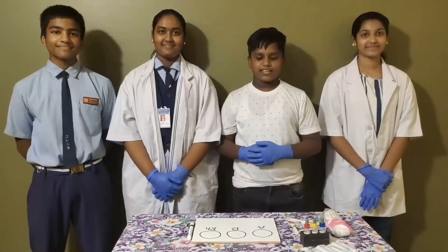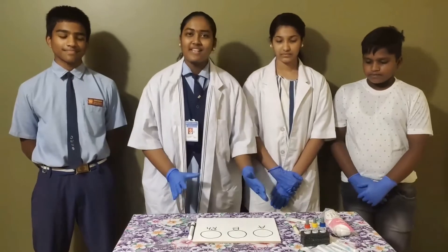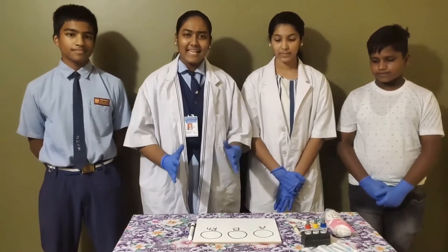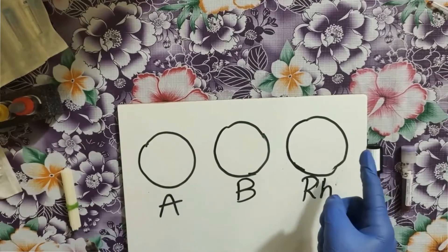Now let's start the experiment. First, what we have to do: take a porcelain white plate and draw 3 circles with a wax pencil. Name them as A, B, and RH. Now we need to put the blood sample in these 3 circles.